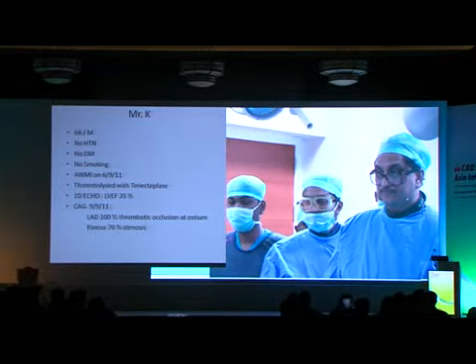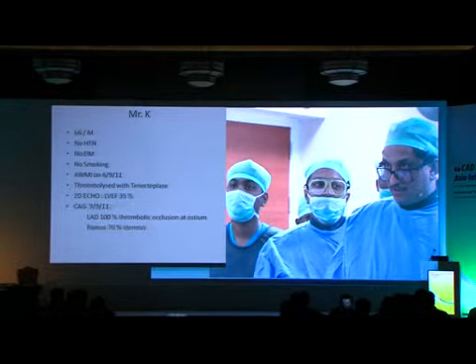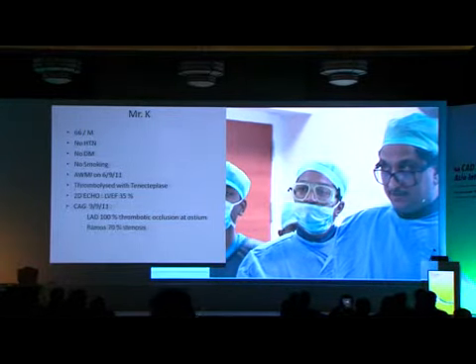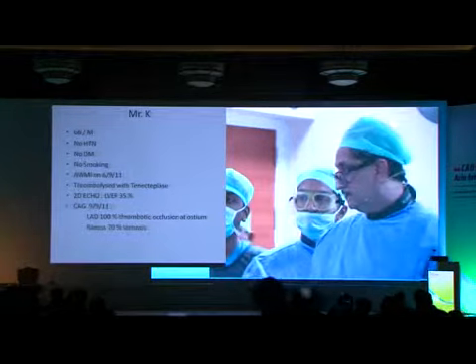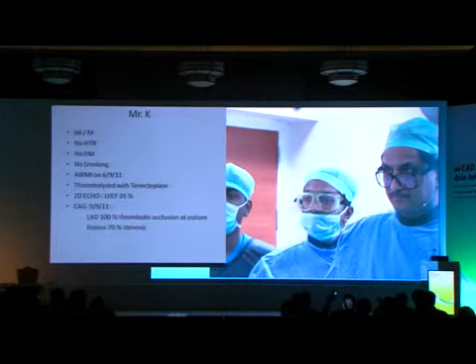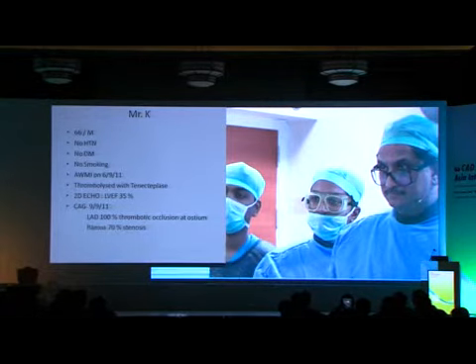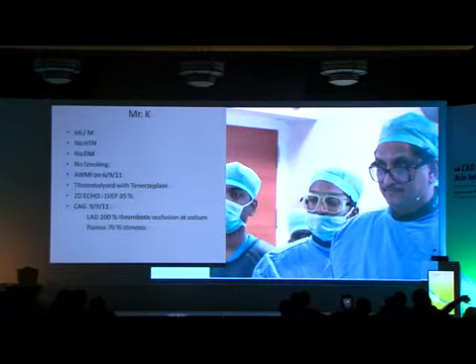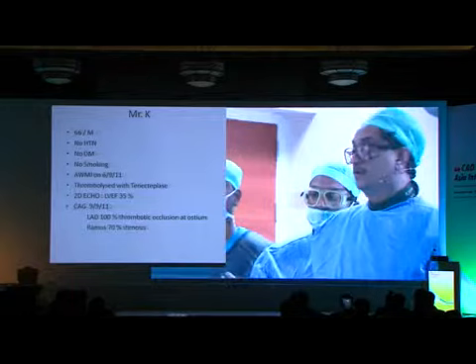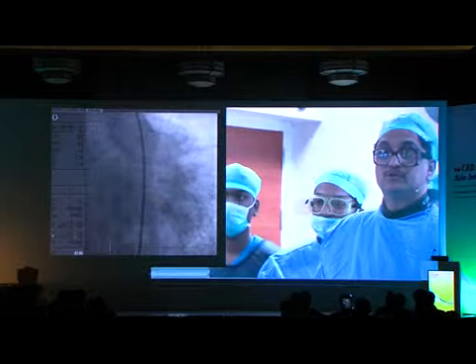This is a 55-year-old gentleman. Had an anterior wall infarct, was thrombolized with tenecteplase. It's around 3 weeks. And just show you the angio. Just playing the angio. We are not able to see the angio. They've not seen the angio. Show them the angio.